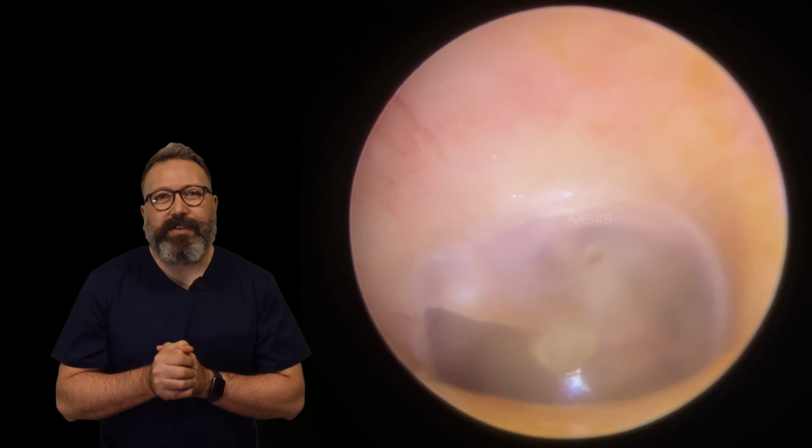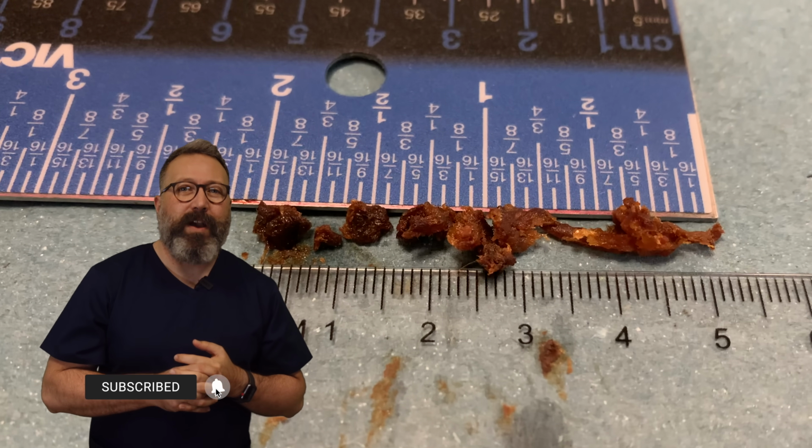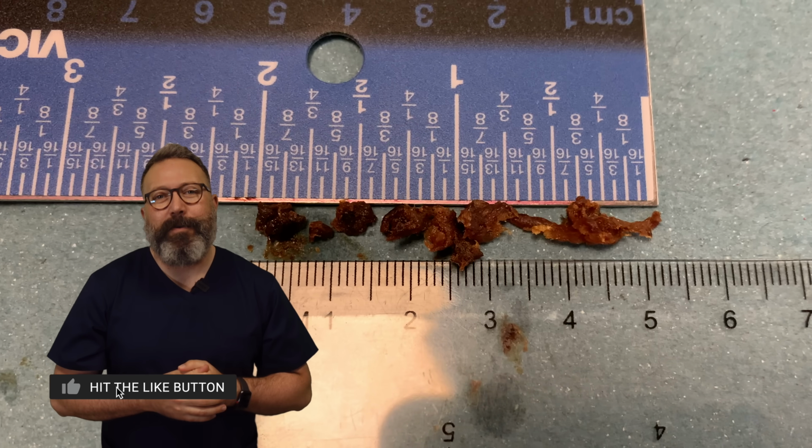So we'll show you what came out. So this is what we removed. So you can see we've got 5 centimeters, 2 inches worth of wax. That's an easy one to read in inches. Come out of both ears there.